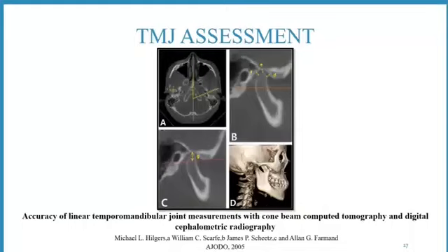The bone morphology of mandibular condyles can be easily traced or detected by the CBCT images. CBCT is also useful in detecting bone diseases such as juvenile idiopathic arthritis, condylar hyperplasia, and many other joint-related diseases. CBCT is considered the supreme method to render visualization of many anatomic variations.